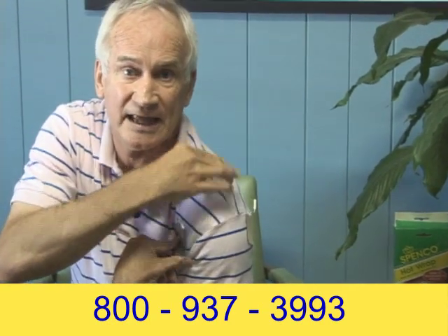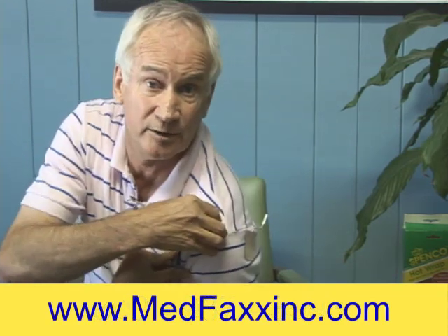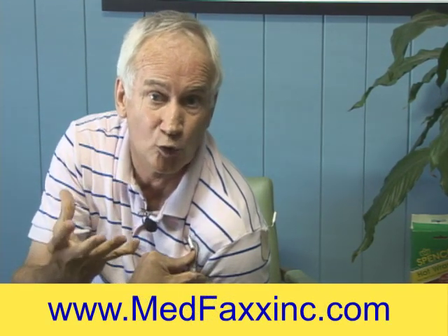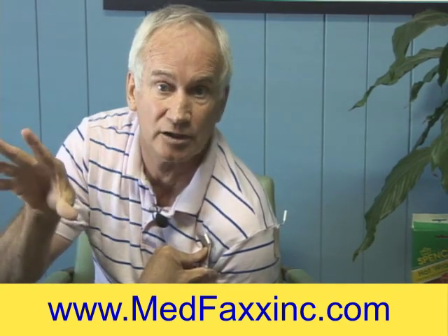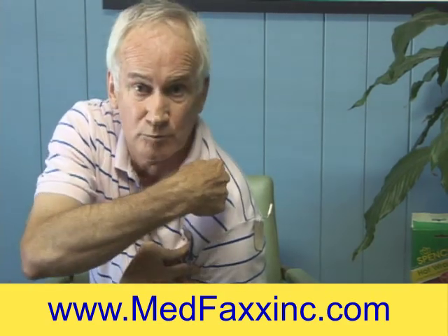What I'm looking for — and so you understand — I really don't want to be near a bony prominence. The reason I don't want to be too near the bone on your shoulder is there's less fluid there. Muscle tissue has a lot of fluid, which means it can conduct electricity. What I'm doing is targeting the pain in your shoulder.